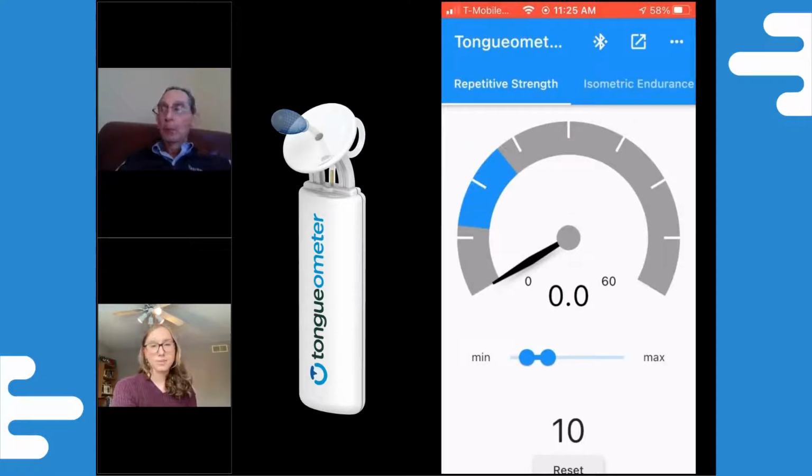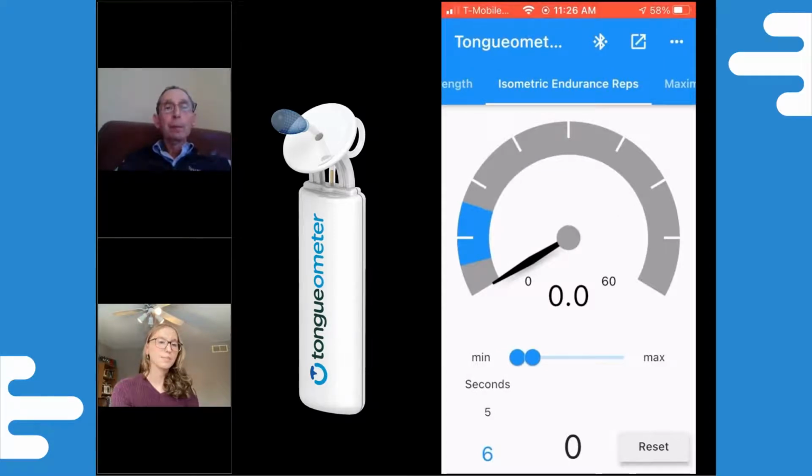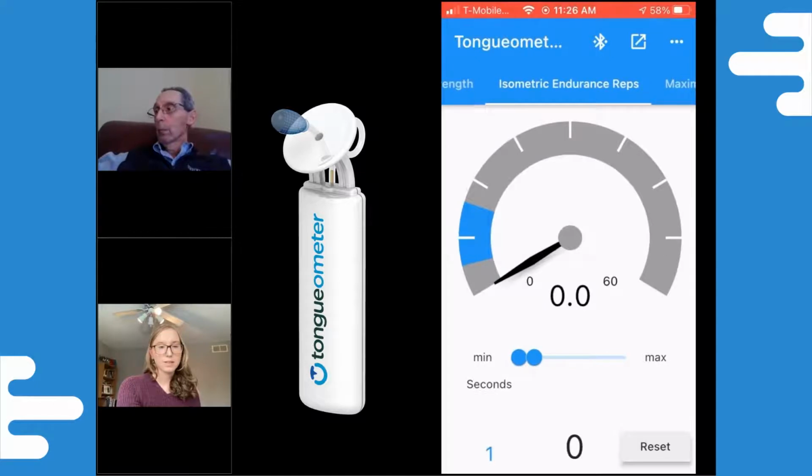The other exercise module here, Ed, if you swipe to the right, is the endurance exercise. So this one, similarly, you set that target range to whatever's appropriate for the patient. And then the second part of this is you set the number of seconds you want them to hold that pressure in that highlighted range for. So for this one here, we'll have Ed set it to maybe 5 seconds.